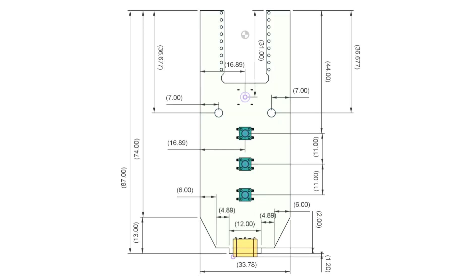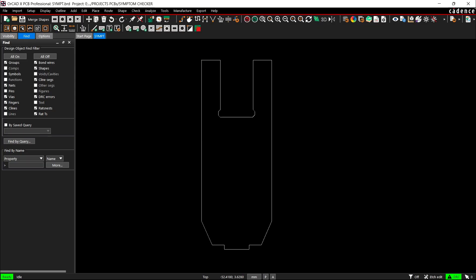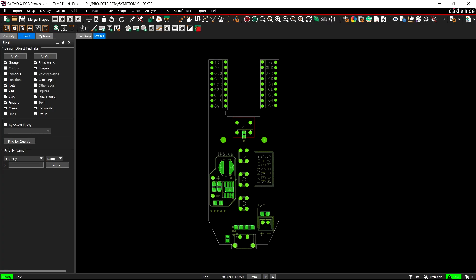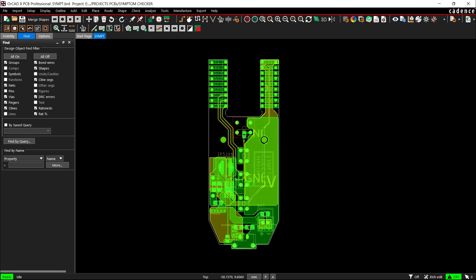Using the dimensions from the CAD model, we prepared the PCB outline and then placed the buttons in their mounting positions as specified in the design. We did the same for the Waveshare ESP32 board, the Type-C port, and other mounting holes. The rest of the components were placed wherever we found adequate space, and then we connected the traces and finalized the board.